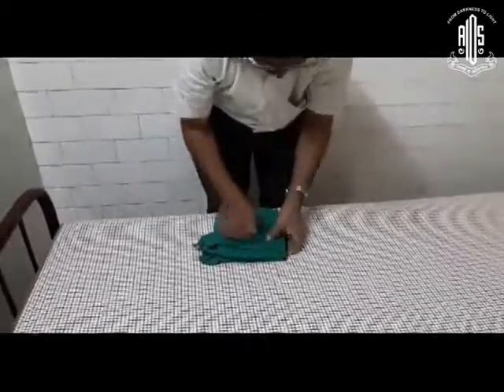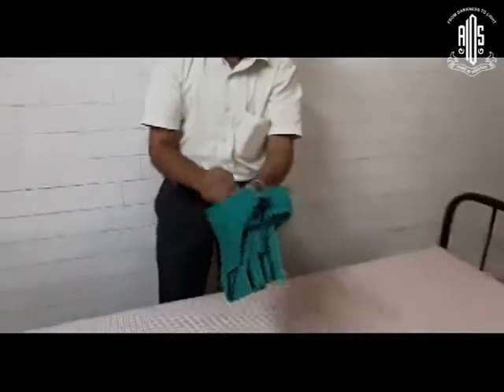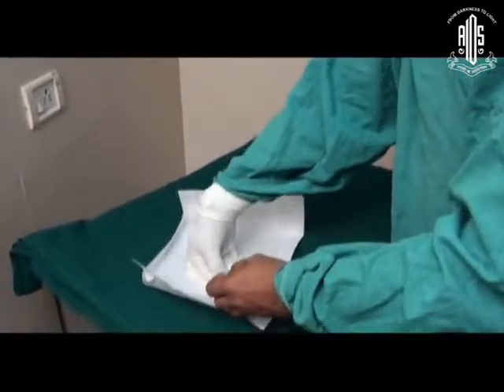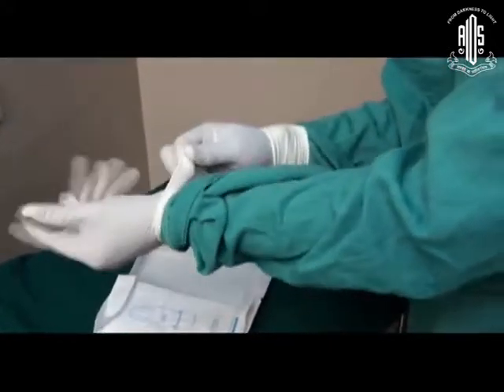If you autoclave the gown folded this way, when you take it out you just put your arm inside and it opens up — it's a beautiful way of doing it. Once you have worn your apron, you put on the gloves. The no-touch technique is advocated, but there are problems with it that we'll be showing now.